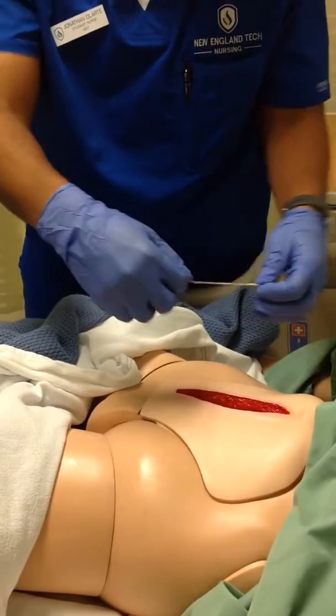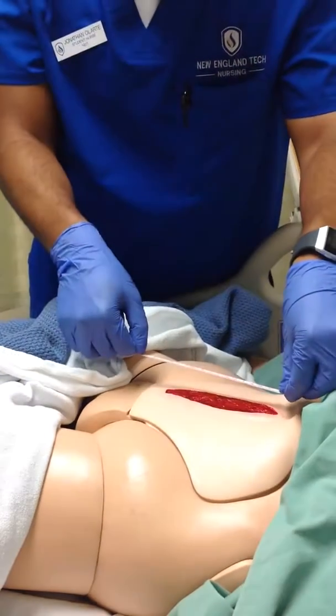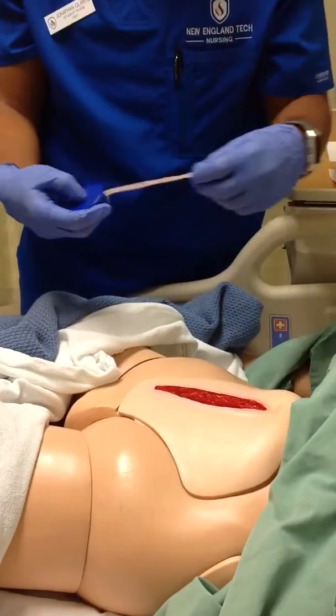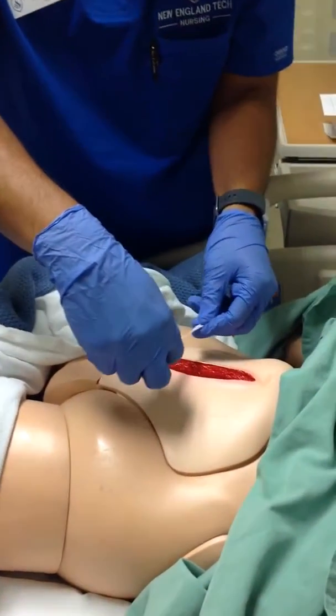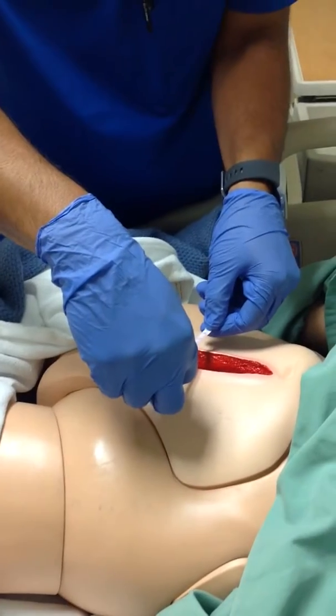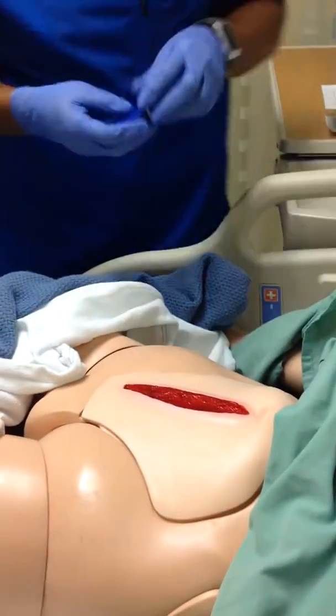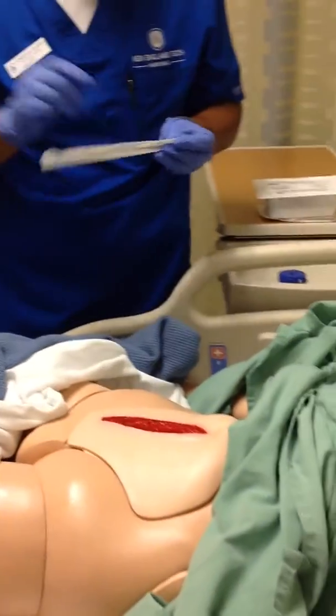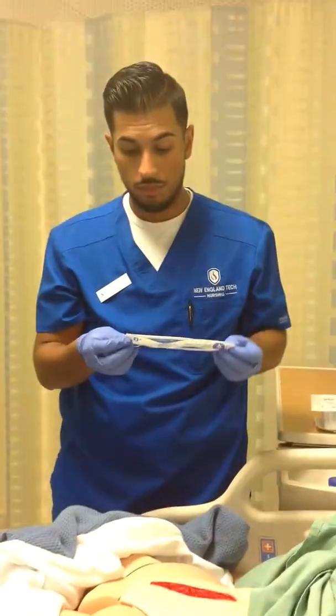In centimeters, I would measure the length, which is about 13.5 centimeters, and the width, which is about 2.5 centimeters. I would then want to measure the depth of the wound using a sterile cotton-tipped swab.